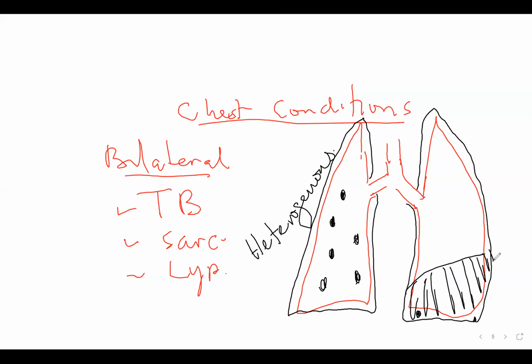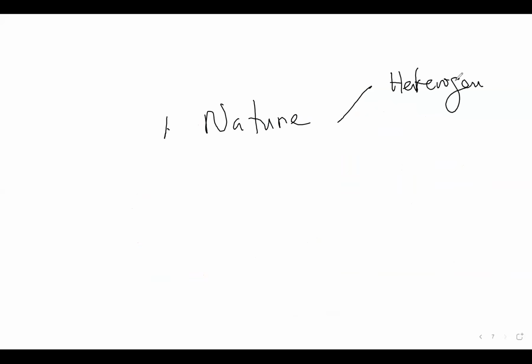If you see an opacity on an X-ray, one, the nature of the opacity, whether it is heterogeneous or homogeneous. Two, you look at the mediastinum, okay?